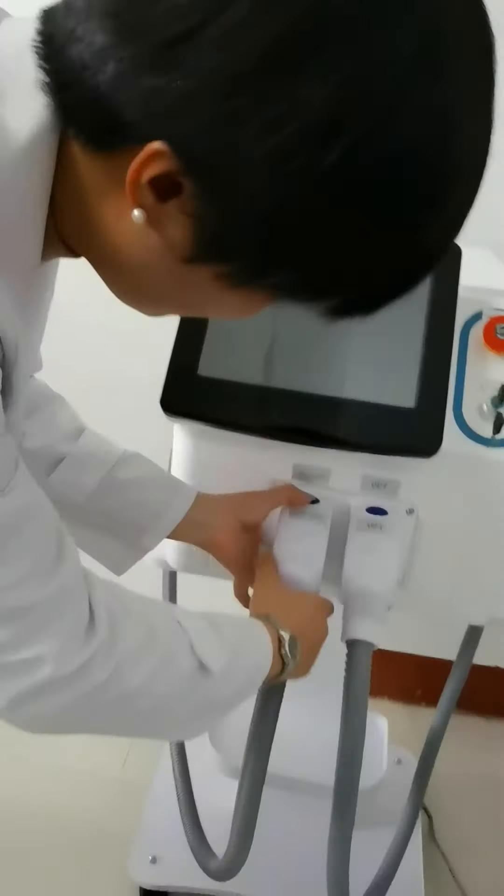How to connect the handle? Let me show you. You need to press the blue button, press it and take the handle off. When you want to connect it, you need to align it using the strings. If the handle is connected successfully, you can hear a click — that shows the handle is connected. The two handles connection method is the same.